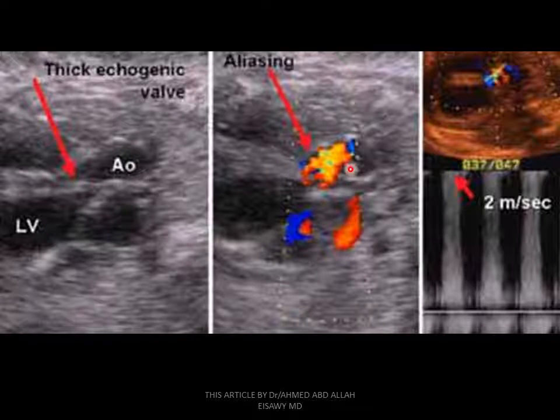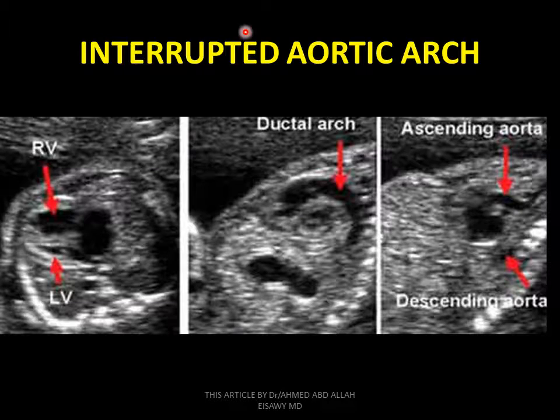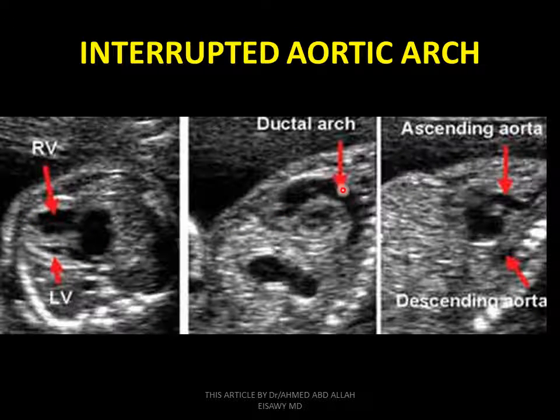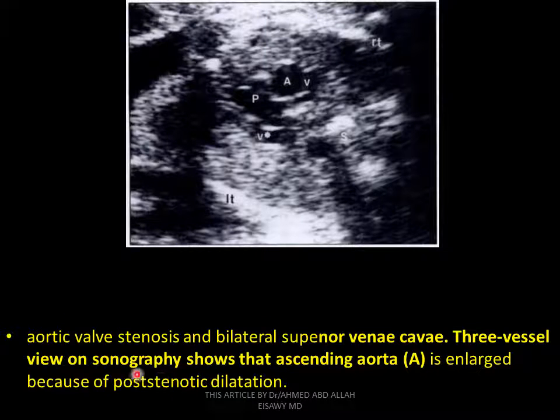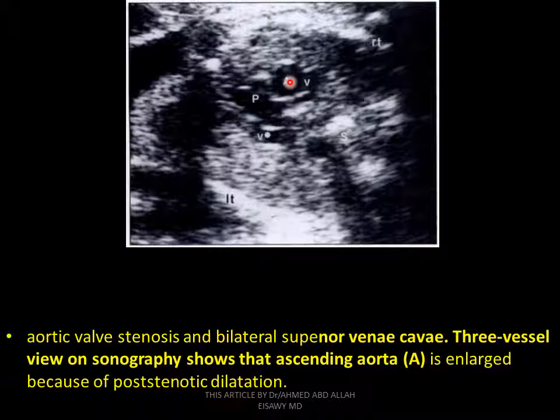This is the left ventricle, right ventricle, ductal arch, and ascending aorta. Interrupted aortic arch: hypoplastic or interrupted. Aortic valve stenosis with bilateral superior vena cava. Three-vessel view on sonography shows the ascending aorta enlarged due to post-stenotic dilatation. Dilated ascending aorta — post-stenotic dilatation — this is a result of aortic stenosis.